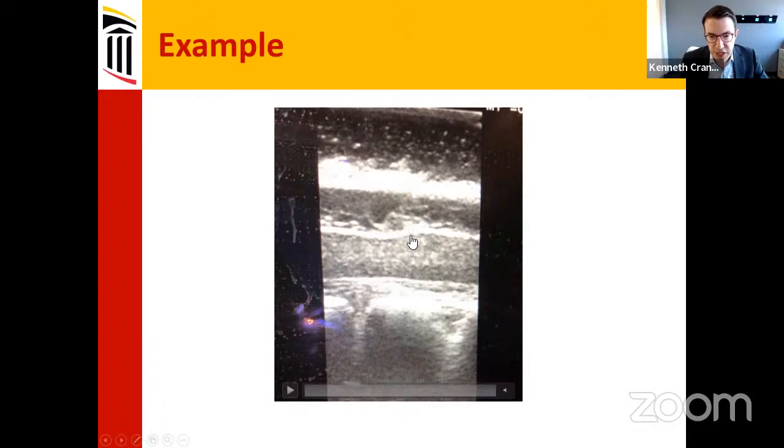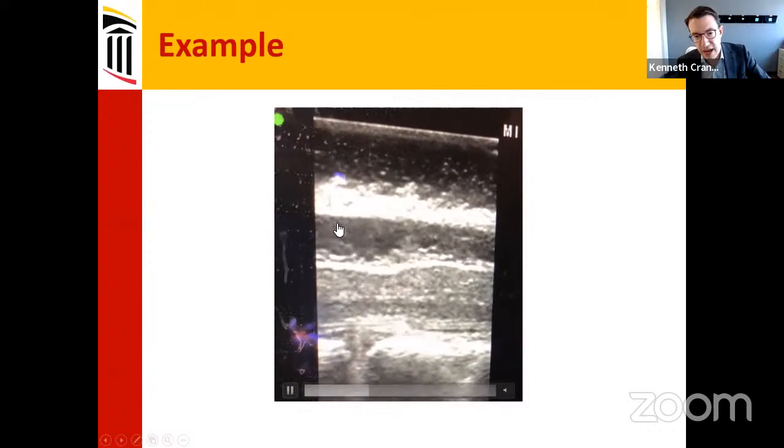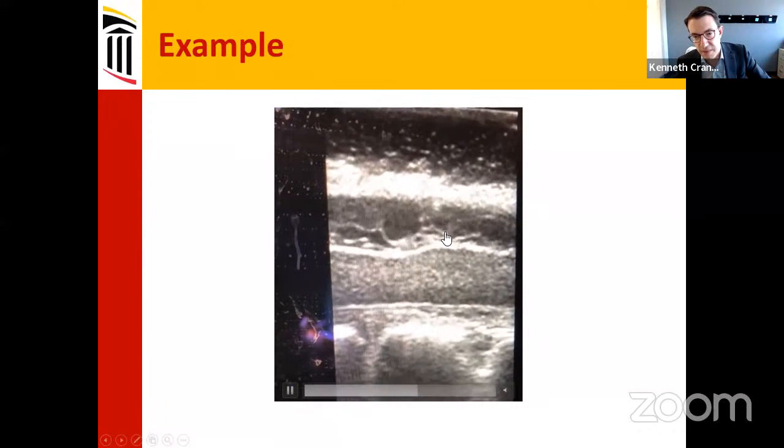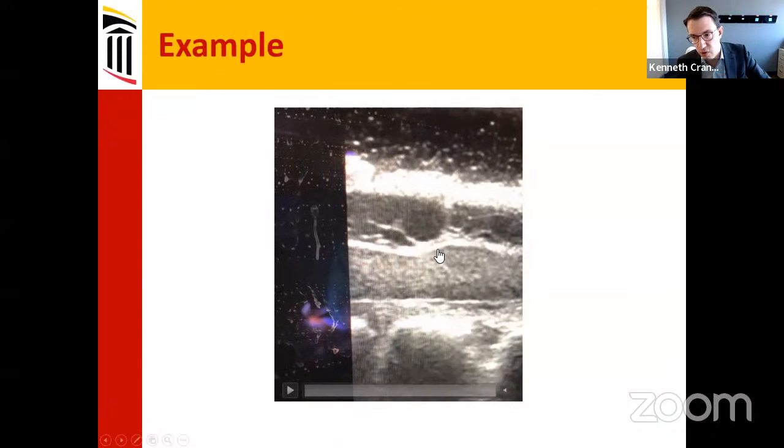This is a case of a patient that had an arachnoid web, which you can see, this is like looking at an ultrasound, you can see how there's this little indentation in the spinal cord. And on the MRI imaging, you could also see that there was some edema within the spinal cord at this level. But when you play the video, you can really see how the pulsations in the arachnoid and how the CSF cannot transmit past this area really pummels the spinal cord at that level. It's almost like the spinal cord is getting punched with every beat of the heart.